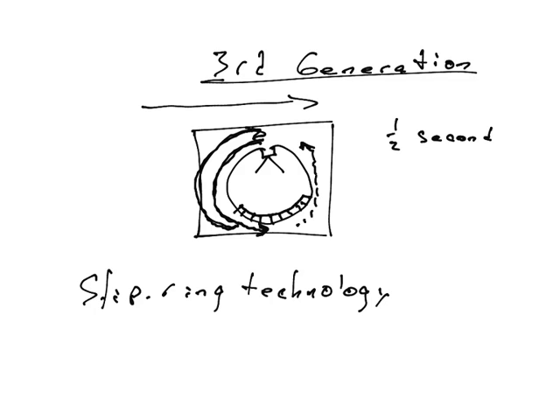So if all of this is wired, if you try to rotate all the way around and keep rotating in the same direction over and over again, those wires will get all tangled up. So instead, it would rotate 180 degrees and then stop. And then to get the next picture, it'd rotate 180 degrees back the other way, untangling the wires. So you never went around a full way, you never tangled the wires. But that made for a slower process. You had to rotate around, then it would stop, then it would rotate back.